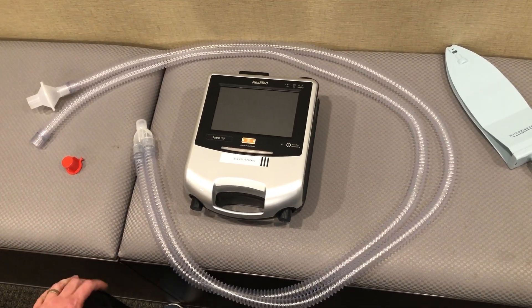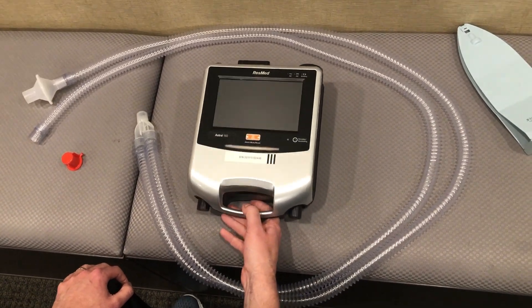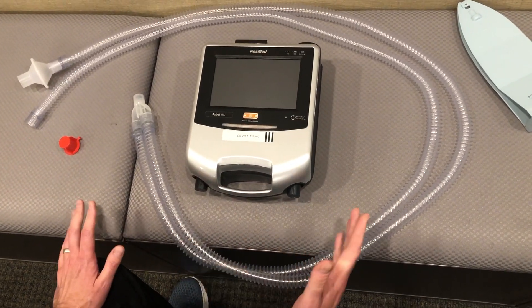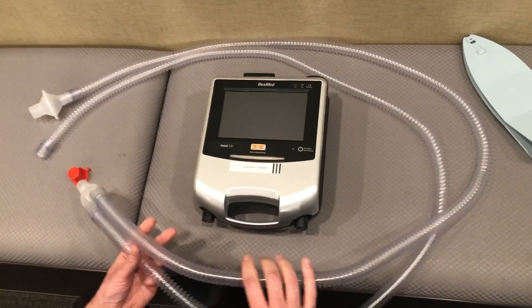Hi, this is Jerome Cambry with ViMed. I'm here today to show you the Astral 150 and how to set this up for an invasive patient using a double limb setup.